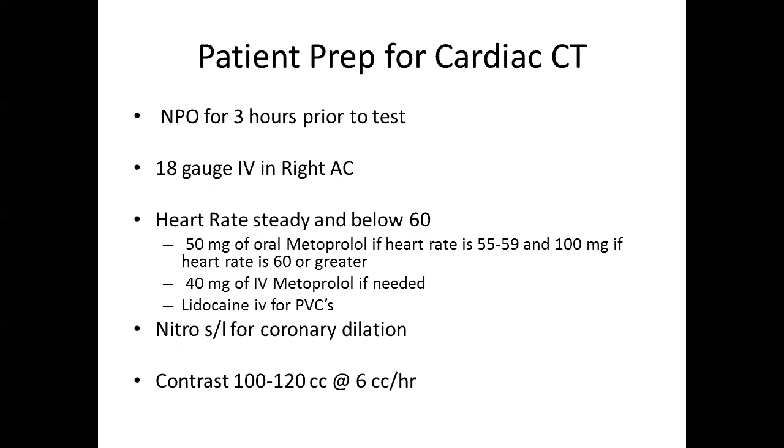Sternotomy wires, I haven't seen that be a problem. And what was the other thing? Breast implants. I can't remember having done a scan, so I can't speak from experience, but I think it should be fine. And it works really well. So we'll talk about that.